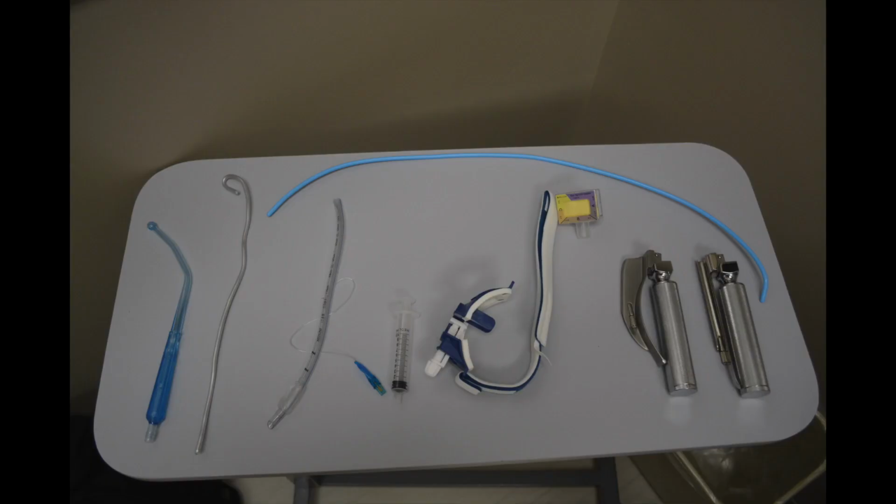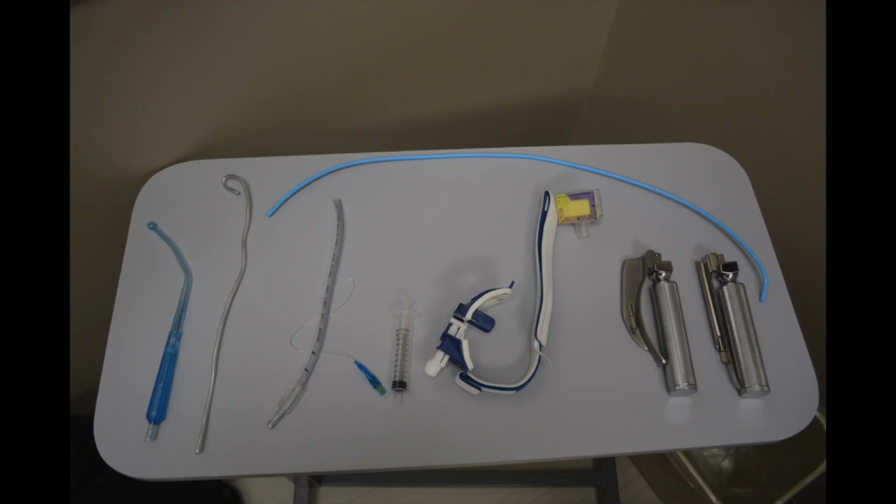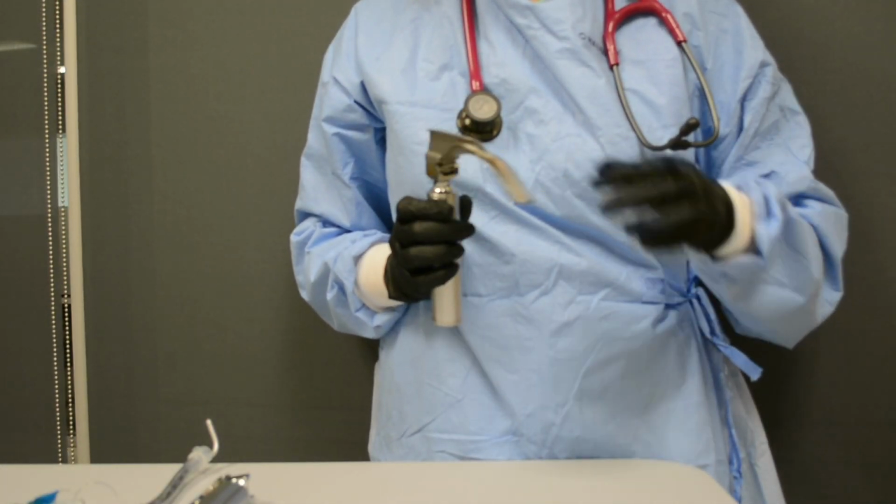Supplies needed include a laryngoscope, suction, sedative and paralytic drugs, 10 cc syringe, endotracheal tube, stylet, tape or ET tube holder strap, capnography, and a bougie in case of a difficult airway. Make sure the laryngoscope light works.